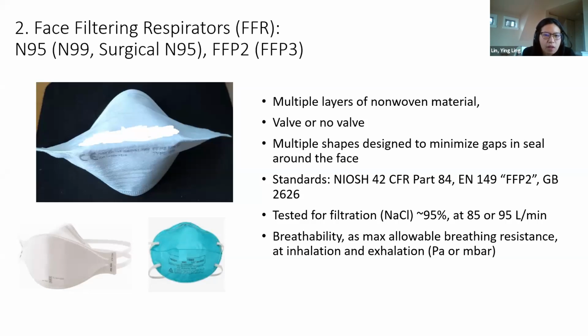They may be valve, non-valve. They're made up of more layers than medical face masks, which are 3. So it could go up to 7, 9, and sometimes they're more rigid structures like the green one that you see below, or the panel that you see below as well. And breathability is allowed to be higher because it's a thicker material. But this is where a good manufacturer will give you that balance, breathability and filtration.